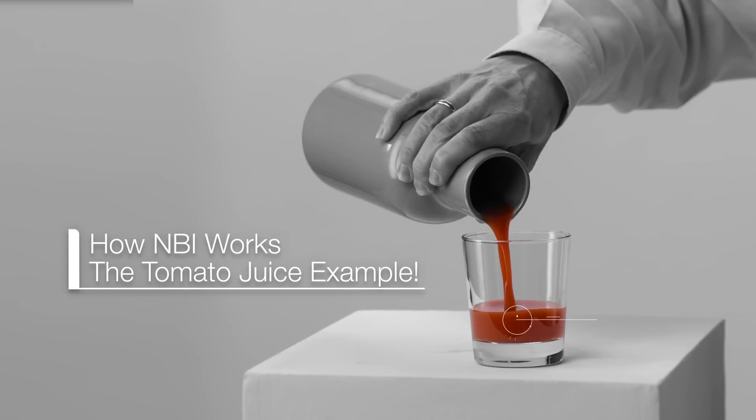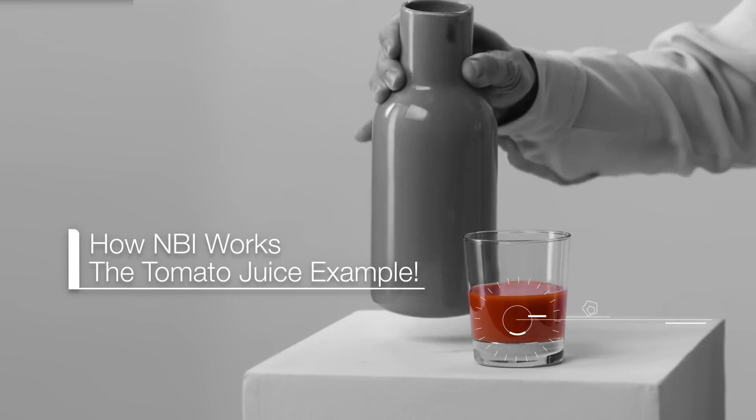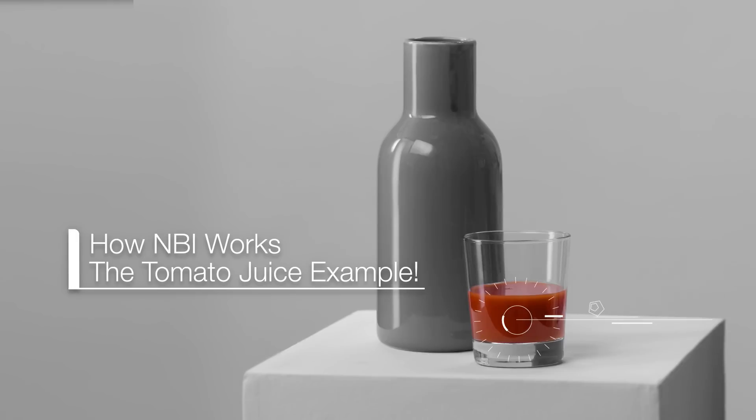The interesting question is: what does NBI have to do with tomato juice?